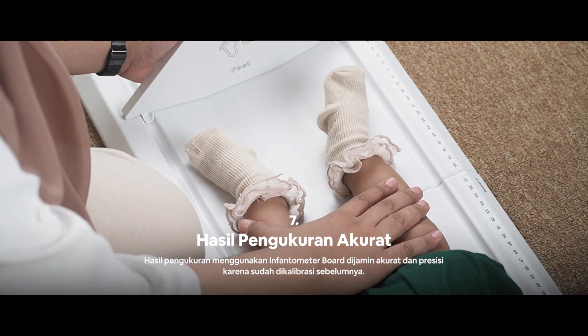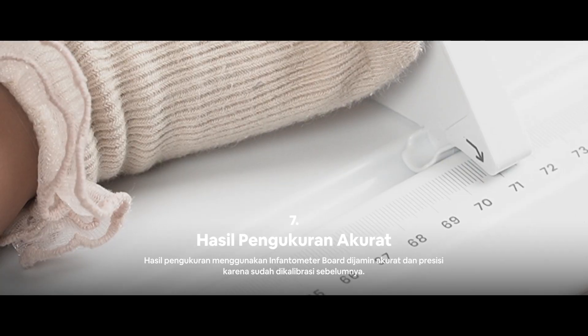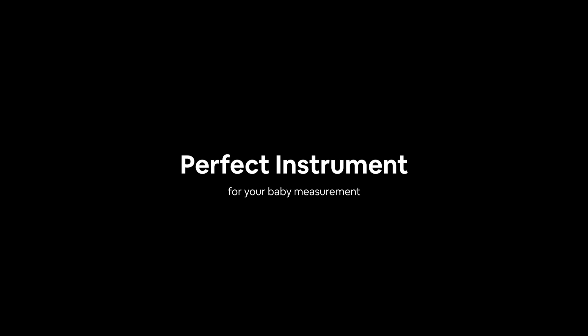Last but not least, the measurement result using Inventometer board is very accurate and precise. Inventometer board — the perfect instrument for your baby's measurement.